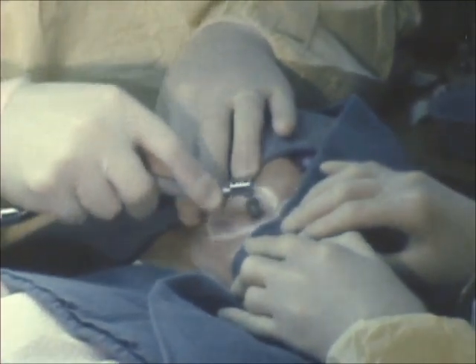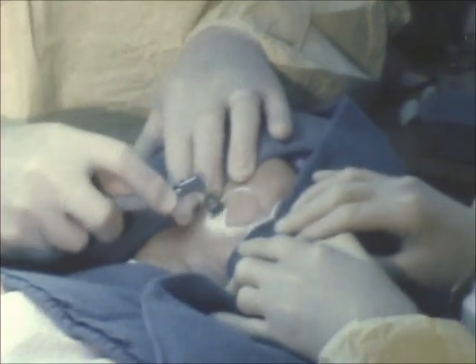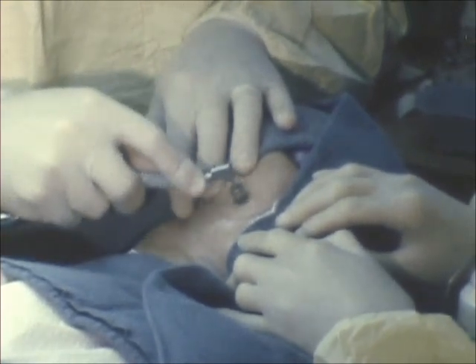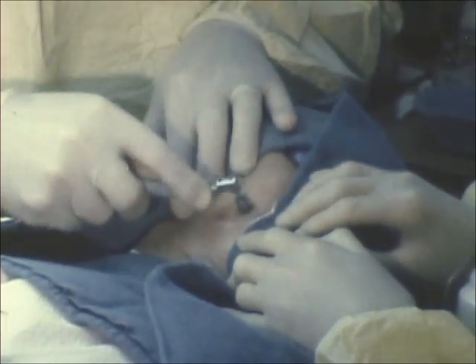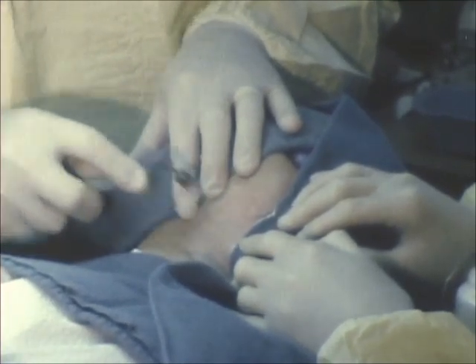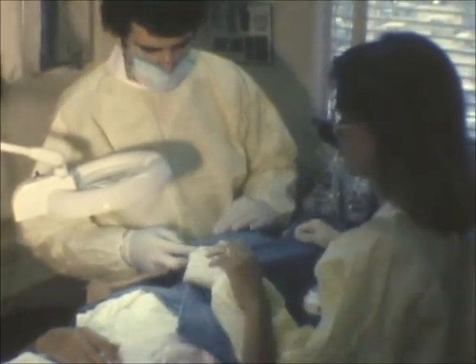We'll then take our brush and lightly abrade the skin. This is called skin planing. After the light abrasion there's a slight oozing, and that indicates that the abrasion was even. We'll continue on to the next area.